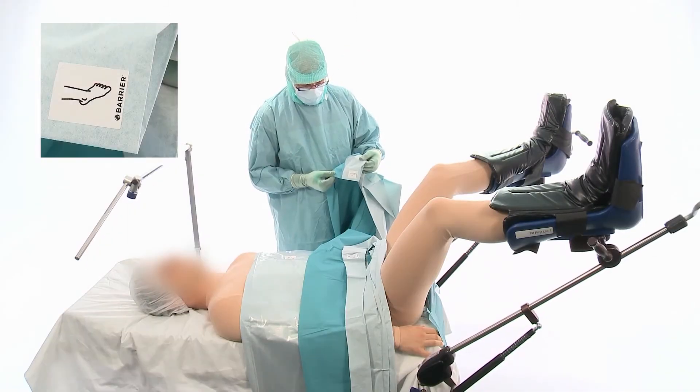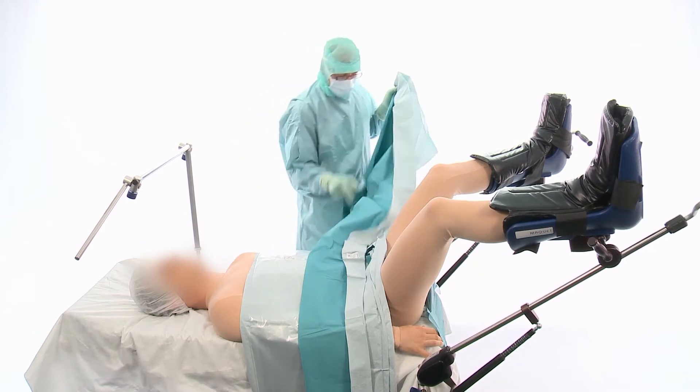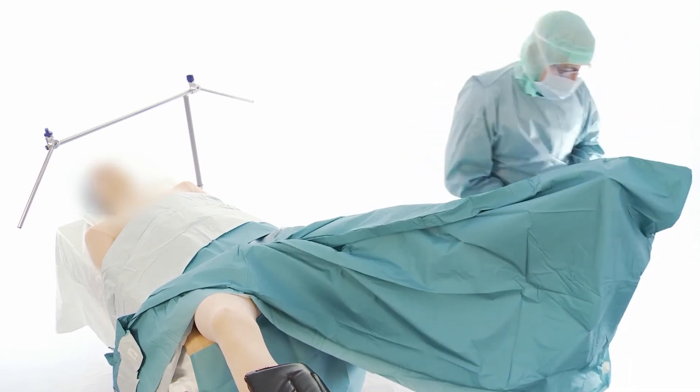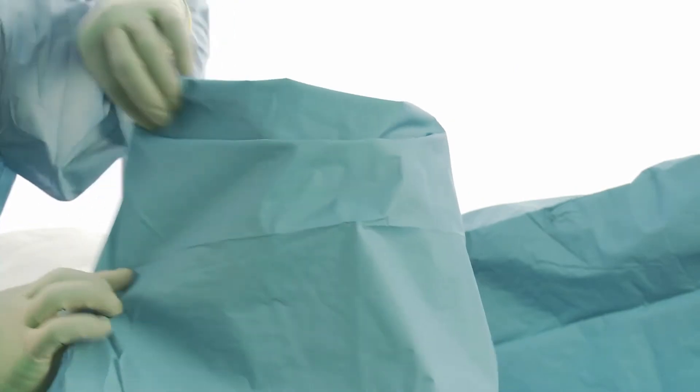See the pictogram of the foot. Take both corners of the legging and unfold over the leg. Do the same for the other leg. If necessary, use the adhesive tape to shorten the legging.